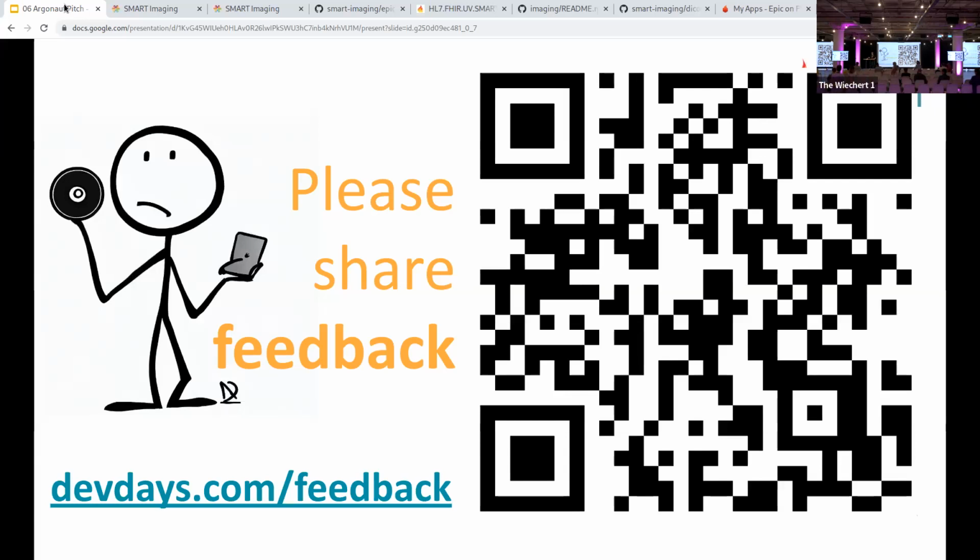I had a small question regarding when the DICOM data is not available, and you said then we will issue a 503, which is normally an error. In FHIR, there is this async request pattern. So why not use that, saying, call me back here, but with a success code rather than an error code? Yeah, so the question is, why not use the FHIR asynchronous request pattern?